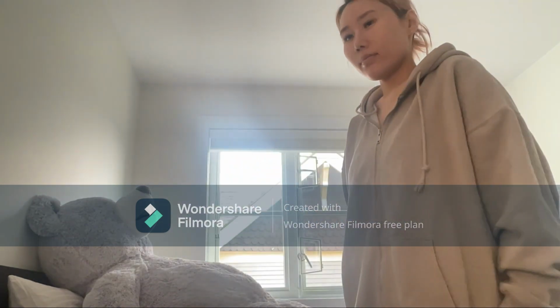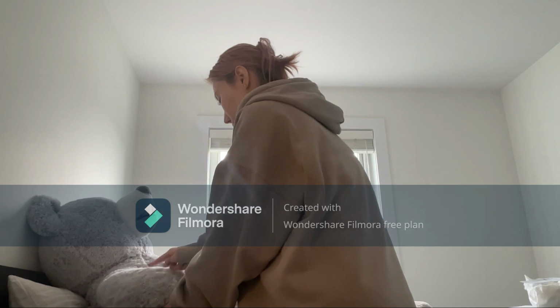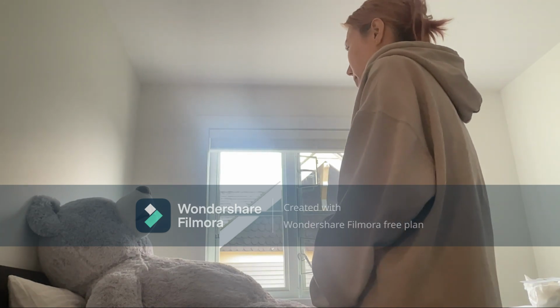Next, the nurse will identify the correct patient using the 3 patient identifiers: full name, date of birth, or medical record number. We will explain to Mrs. P that her doctor ordered a Foley catheter. Hi, Mrs. P. Today we will be inserting a Foley catheter, which will help in carrying urine out of your body into a collection bag.